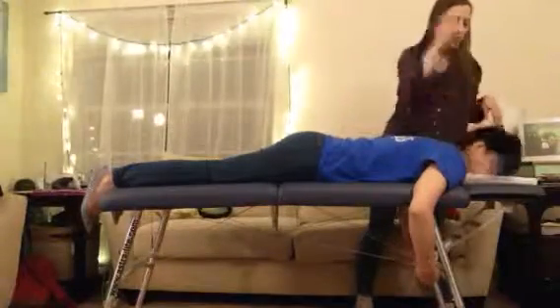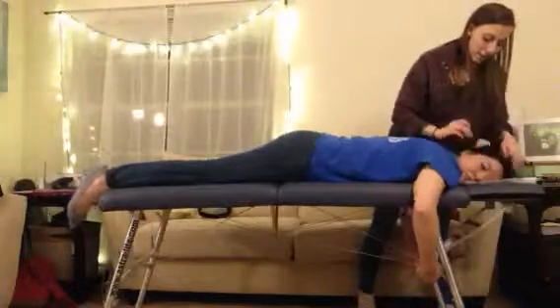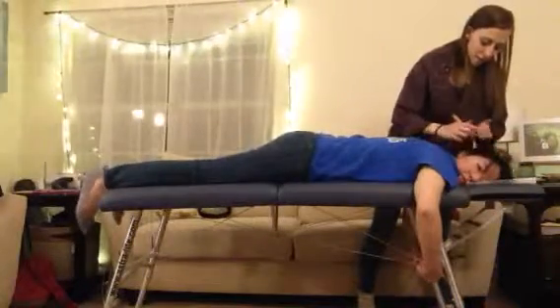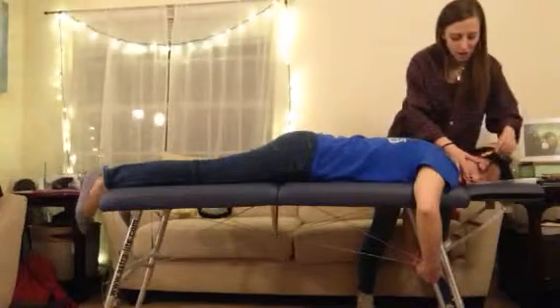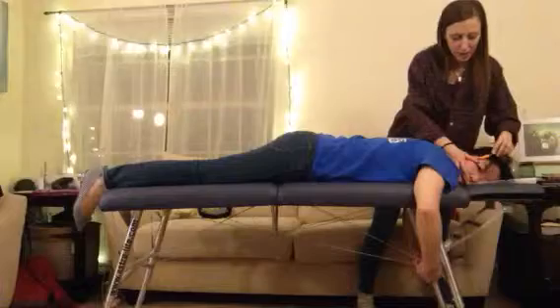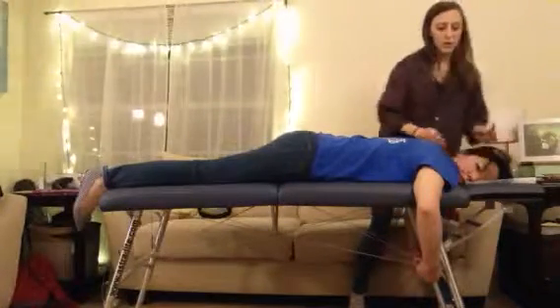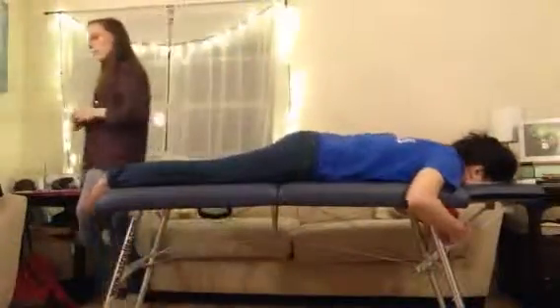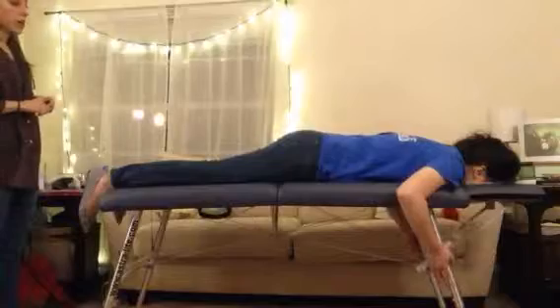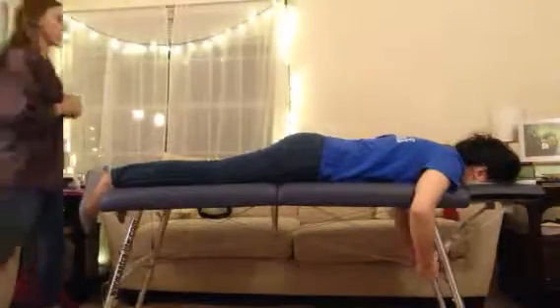Can you turn your head to this side? Okay, so at the lateral canthus, I like to use my thumb to kind of cover her eye. And then we're going to go straight S to I using my thumb to trigger the integrator. Okay. And again, no torque on coccyx or sphenoid. And the next thing we're going to check for is C5 posteriority.